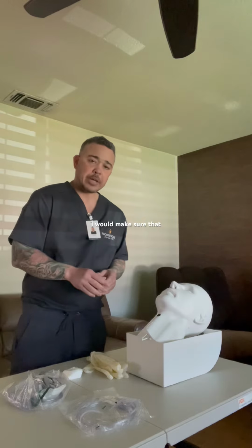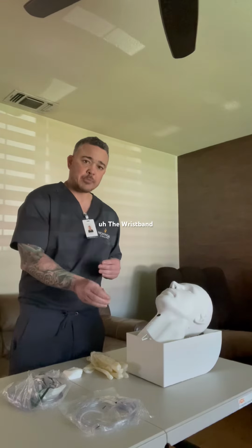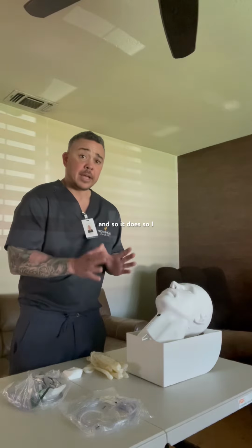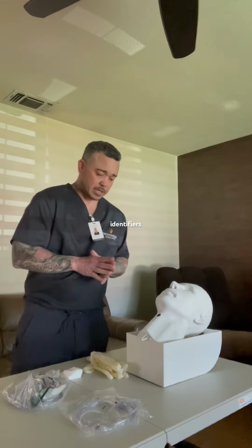Great. Okay. I would make sure that I check the wristband as well to make sure that the name and the date of birth match with the wristband. And so it does, so I have my two patient identifiers.